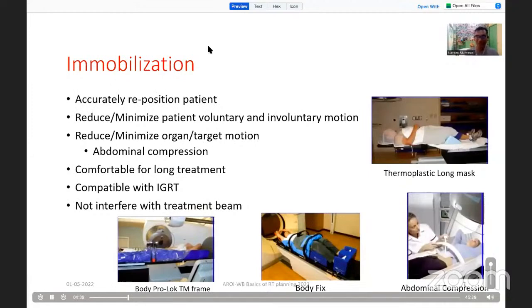In our setup earlier, what we used to do was just use a slanting breastboard or just an armrest, but later we realized that it's not enough. So what we do now is we use the all-in-one thoracic board, where you basically have some amenities so that the patient can keep their hands above their head in a reproducible fashion.